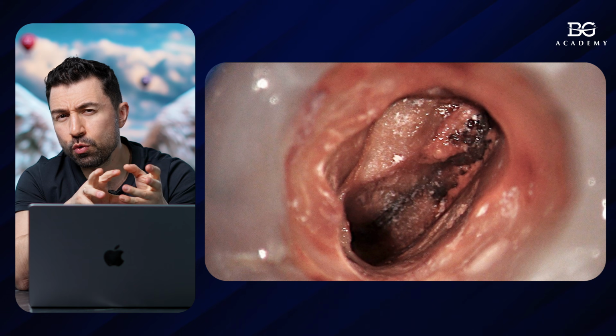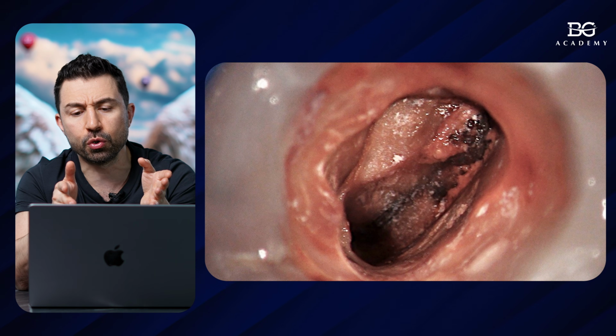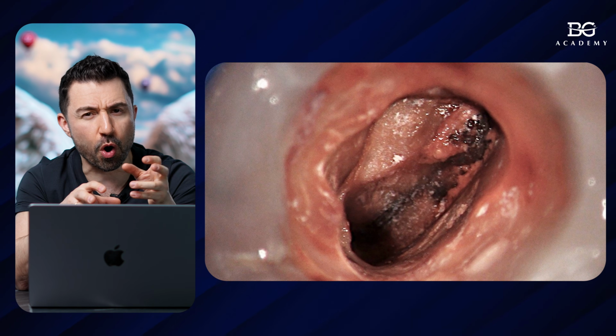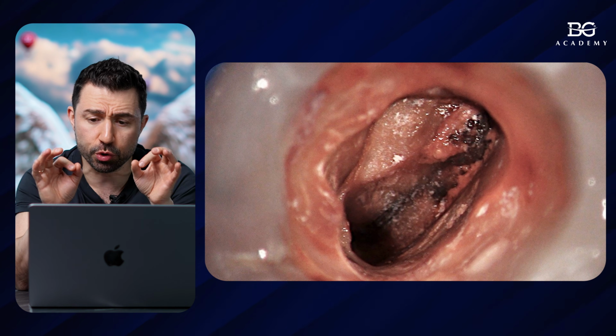And there are a few methods to clean up everything if you have this kind of discoloration. By the way, it may help you also in cases other than resorcinol cases. Maybe, for example, you have a case with silver cones inside, some eugenol paste, and the pulp chamber is very dark and so on. So you can use a few things.